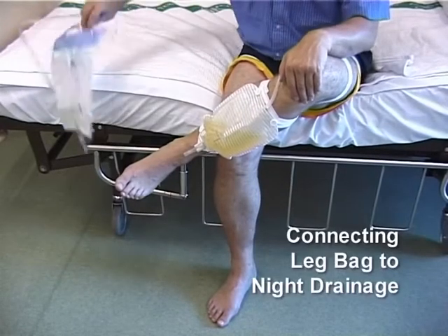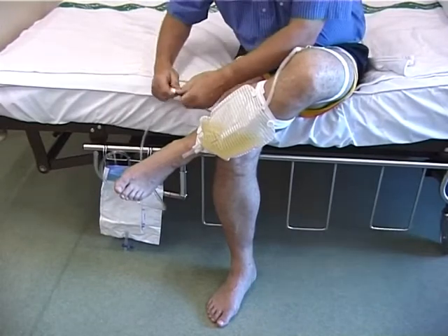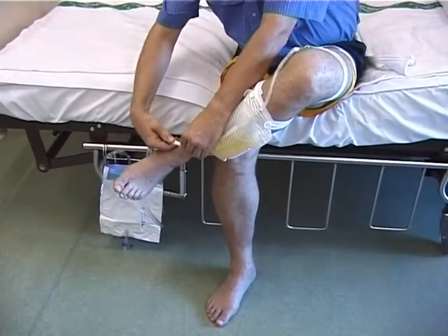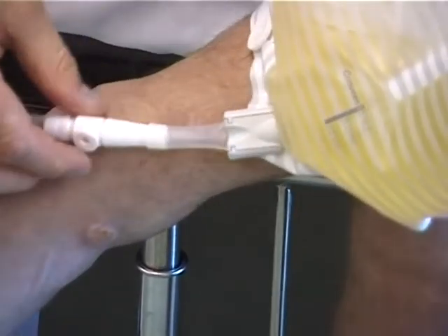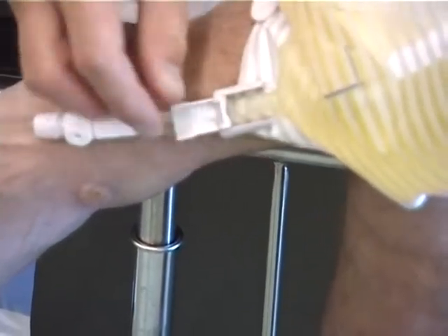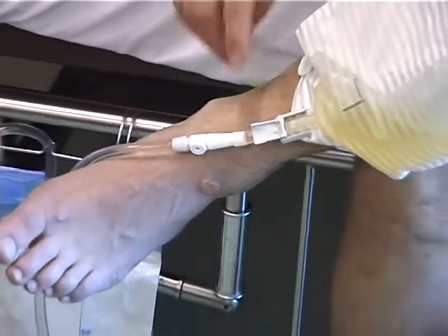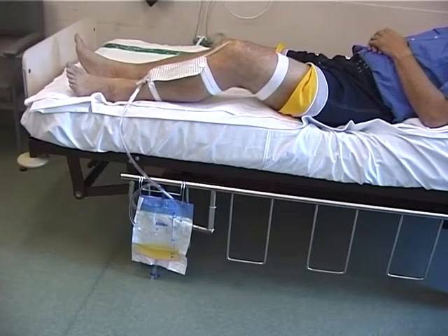Attach the night bag to the leg bag, making sure that the connection clamp between the leg bag and the overnight bag is open, which will allow the leg bag to empty. Arrange the tubing so that it does not kink or loop, and ensure that it hangs freely over the bed and is not directly touching the floor. A suggestion would be to place the bag into a bucket overnight.